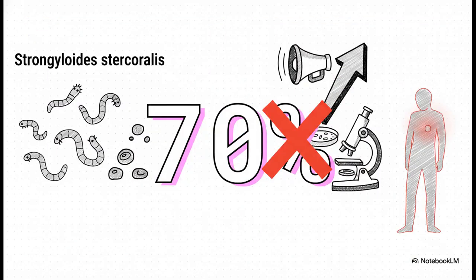And the other huge problem? It's sensitivity. And there is no better or scarier example than Strongyloides stercoralis, because the parasite sheds eggs and larvae so intermittently and often in low numbers, a single standard stool exam can miss the infection up to 70% of the time. Think about that. For a patient who's immunocompromised, that kind of false negative could literally be a death sentence. We just have to have methods that can amplify the signal when we're dealing with a low-level infection.